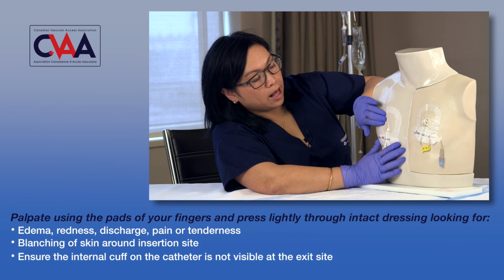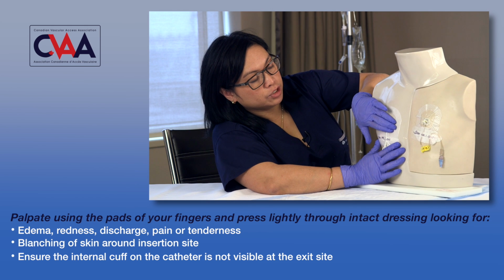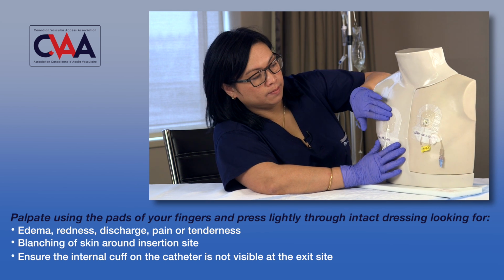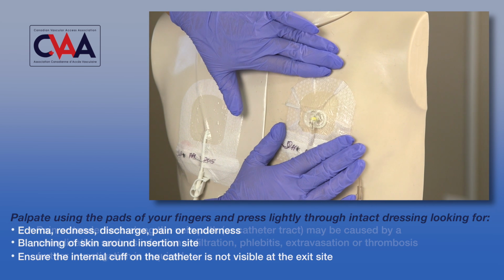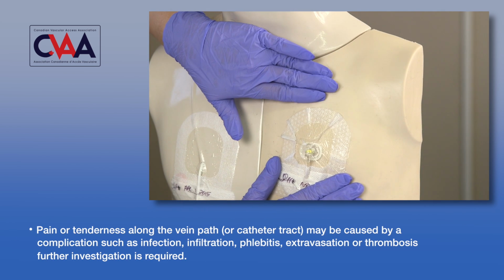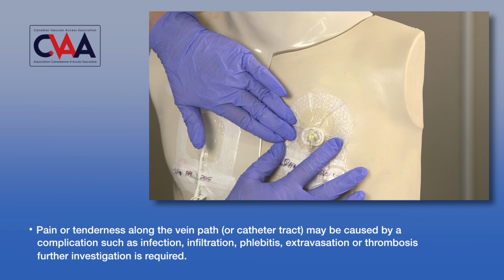You're going to gently palpate around the insertion site and ask the patient if there's any pain or tenderness. In addition, you're going to palpate up along the vein path to assess, again, if there's any pain or tenderness.